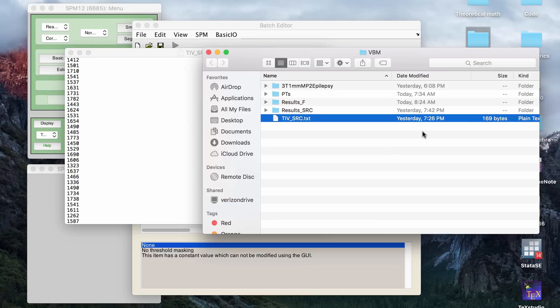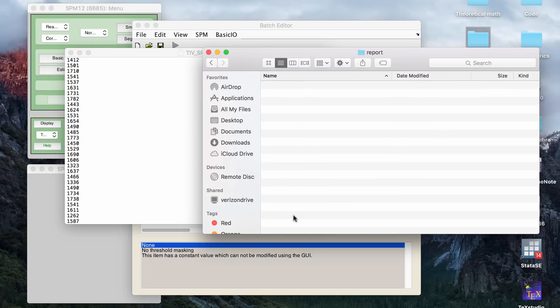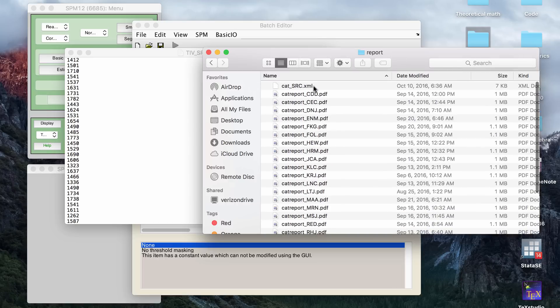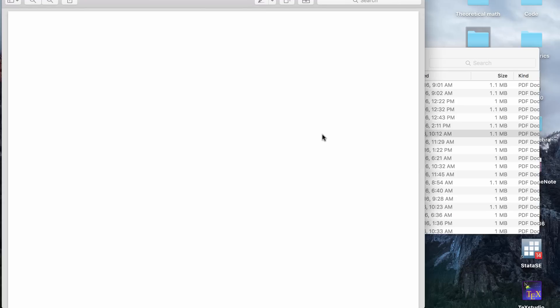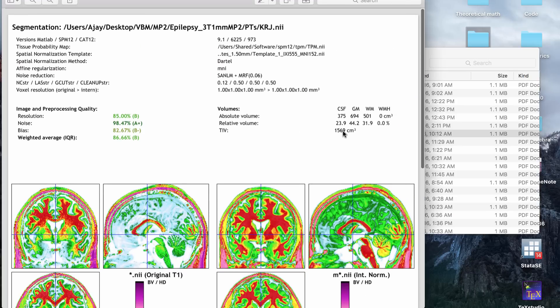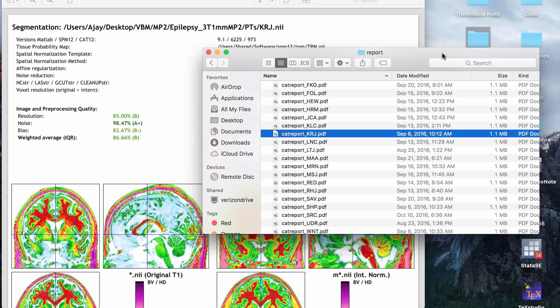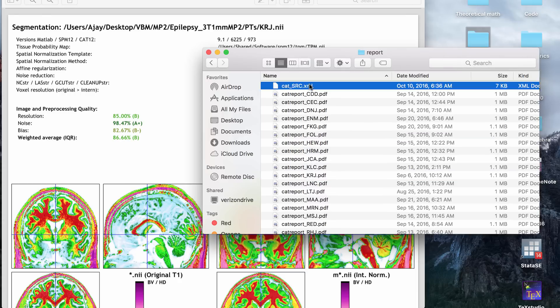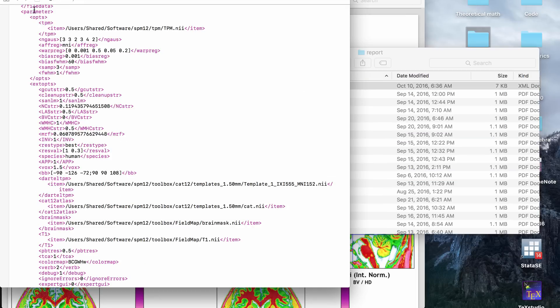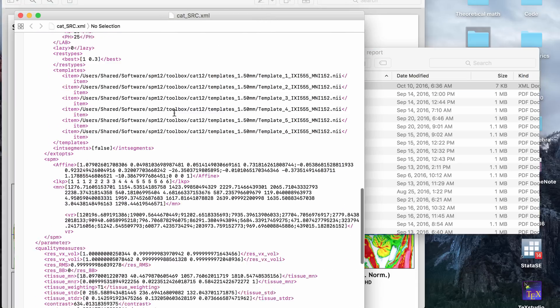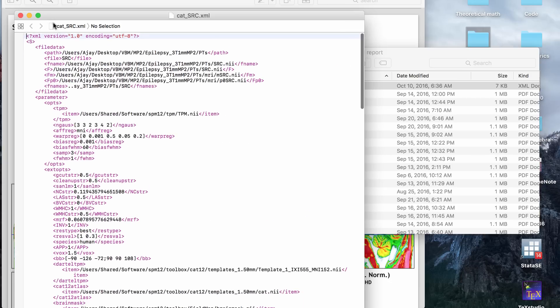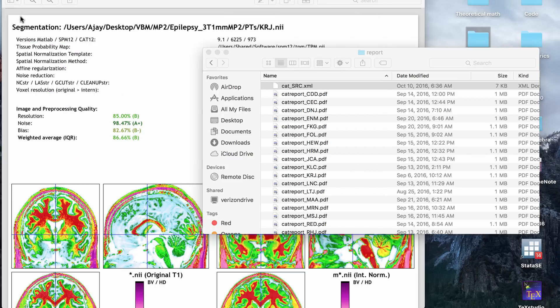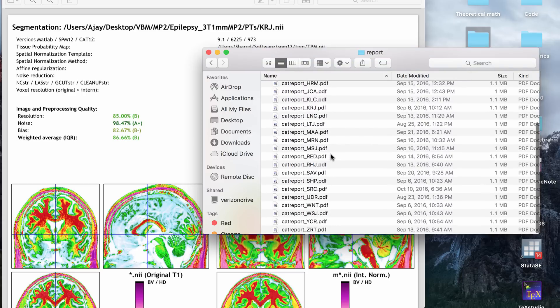So the way you would make a file like this is that every time you do segmentation, there's also a report folder. And this will give you XML files for each patient and also PDFs of each patient. And it has a report of the image quality. And more importantly, it will give you the TIV numbers. So allegedly, the estimate TIV button should be able to extract the TIV information automatically, but it wasn't working when I used the button. If you know how to program, you might be able to write a program that extracts information from the XML files, but I haven't done that. And I've just been doing it manually.